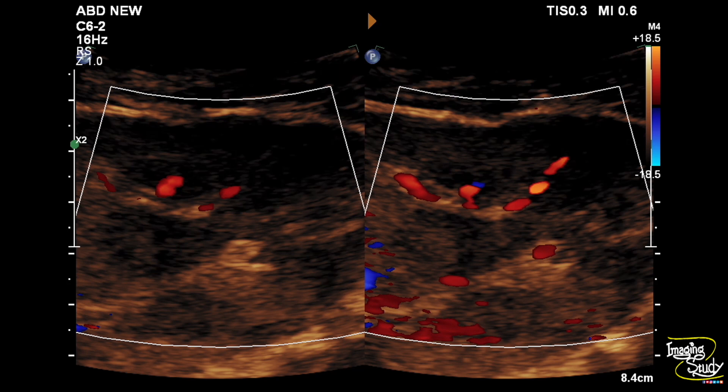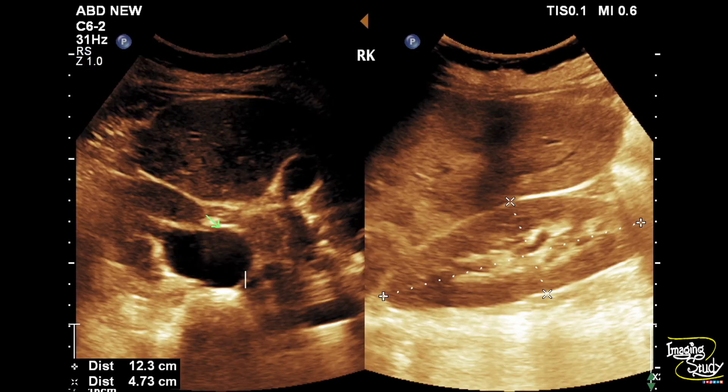On color Doppler, you can see aberrant vessels noted throughout the left lobe supplying the metastatic lesions.